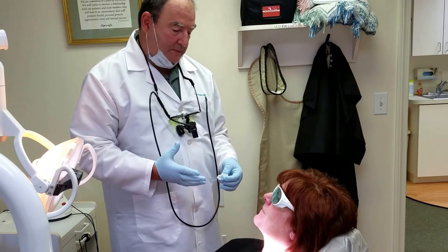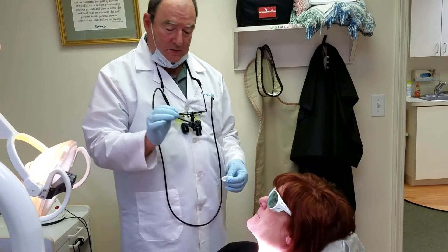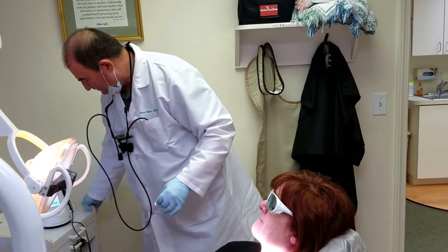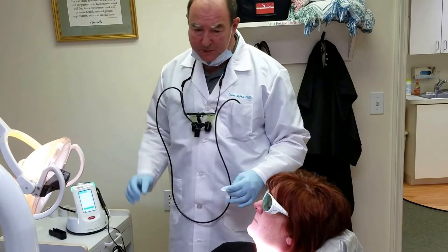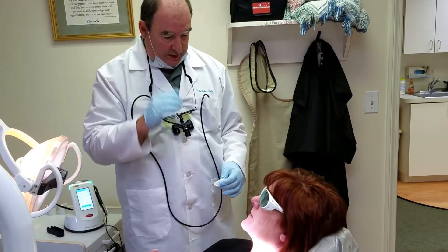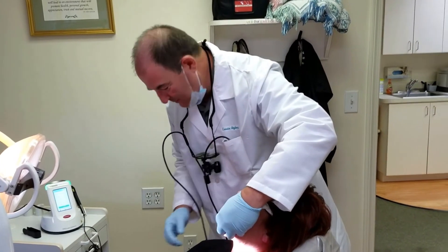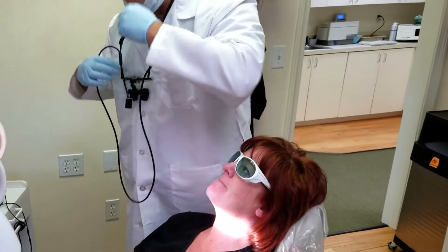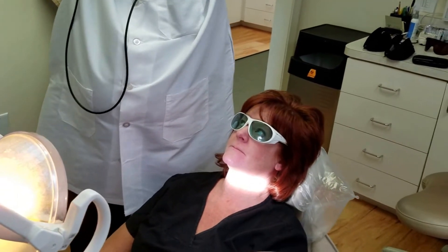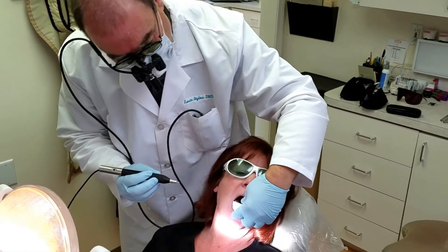So we're going to show you how it works. I've already located it — it's on the side of your tongue. We're going to use this laser right here. We need to have some special glasses on. I'm going to start out way far out, and when you feel that energy, you're going to raise your hand. Notice Lisa has safety glasses — everybody has to wear them because it's a very, very intense light. She's going to extend her tongue straight out; it's very obvious where it is.